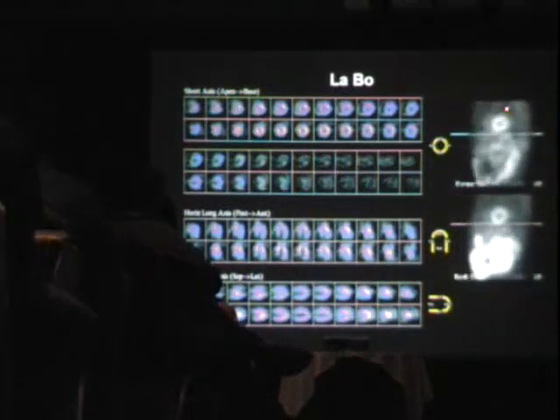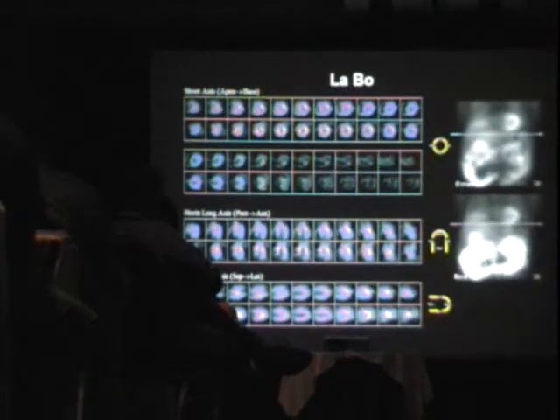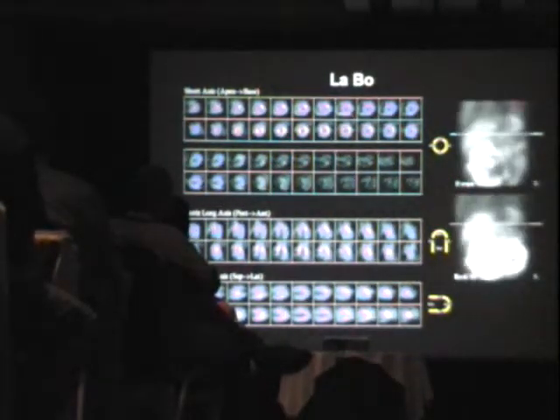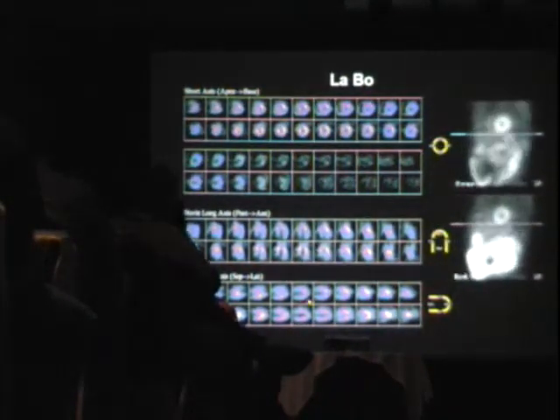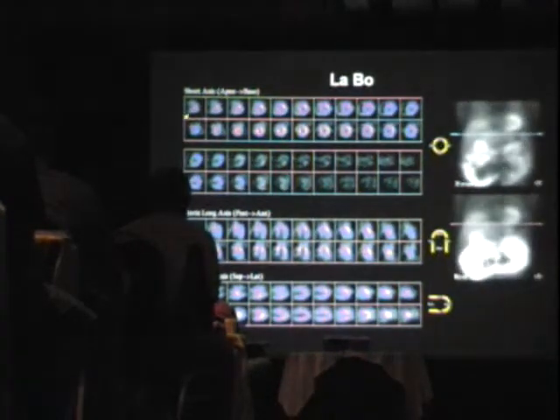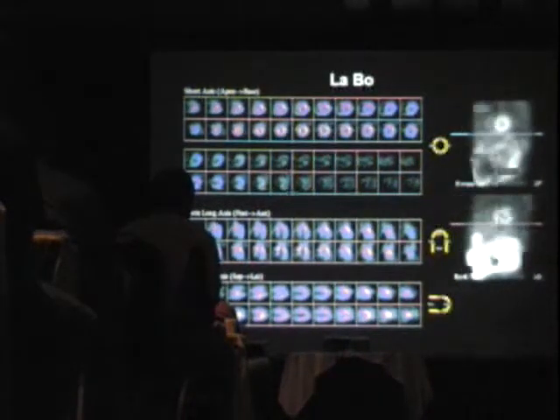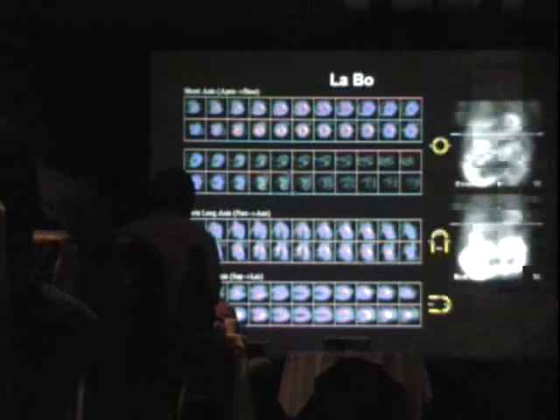particularly the heart. Now, once you are done with the review of the raw data, then you move on to the images. Systematic review, you want to follow first the apex on the vertical long axis, and then go to the short axis and the other axis. And essentially, here we are concerned about perhaps mild ischemia in the inferior wall.